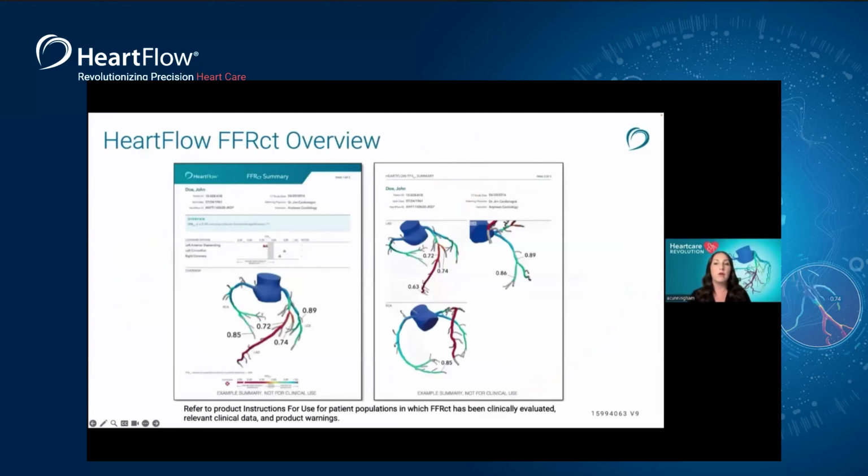Here we can see an example of a HeartFlow PDF that will be sent back to your PACS or alternate EMR destination. You can see patient information on the top and a quick overview of the findings. Next, a quick look at coronary artery with triangles showing stenosis and where it falls on the FFRCT scale. Finally, an image of the patient's model with lesion-specific pins placed. Each pin placed is where HeartFlow observed a 30% or greater decrease in lumen diameter. The next page shows coronary and lesion-specific pins placed in the most distal or nadir FFRCT values for the vessel.